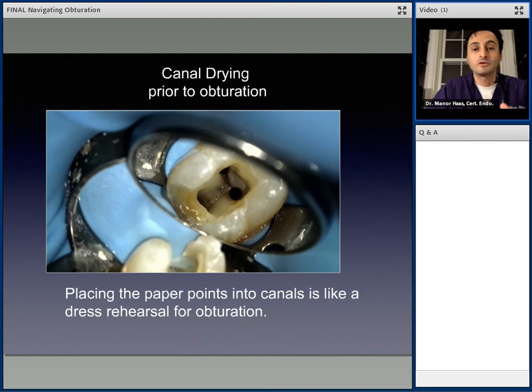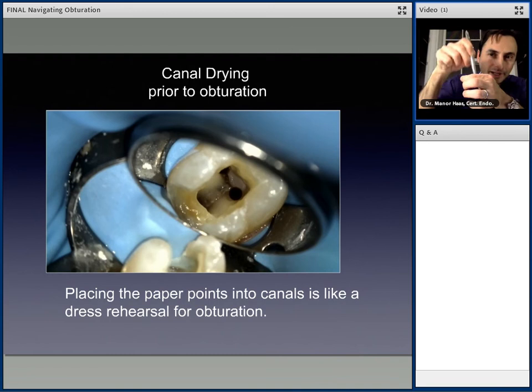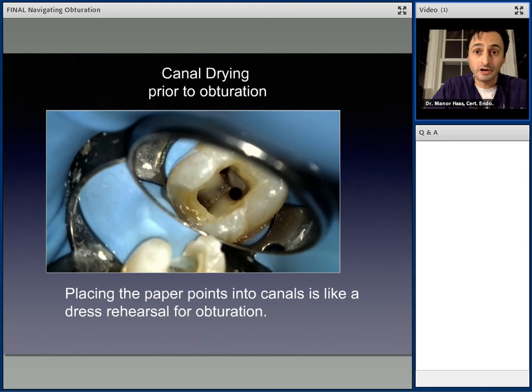Gutta core, on the other hand, because it's all gutta percha, if you're applying too much pressure, if it meets resistance, if it converges with another canal apically, then any extra pressure is pushed back out coronally. That is phenomenal and very important, and that's a key reason why I find with gutta core there's much less apical extrusion than with carrier-based obturation systems, or even, believe it or not, with warm vertical obturations. Because what if you're not that comfortable with it? What if you push that plugger into the canal just a little bit too much and now you've extruded it? The way the gutta percha's viscosity, the way it flows, the way it's engineered, too much pressure and it extrudes coronally. And that gives me a lot of peace of mind.